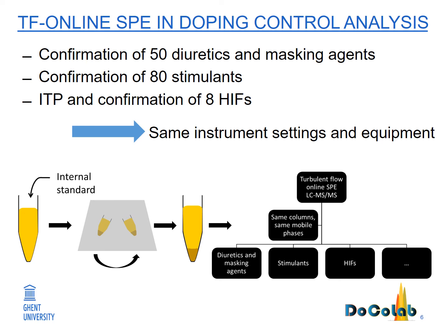Currently, we are also looking into applying this technology for other classes of compounds on the prohibited list. All these developed methods use the same instrument settings and equipment, so there is no need to change the configuration of the instrument when switching between methods.